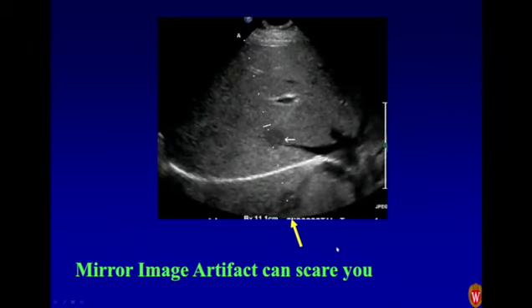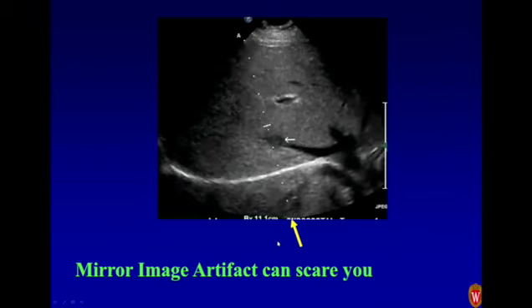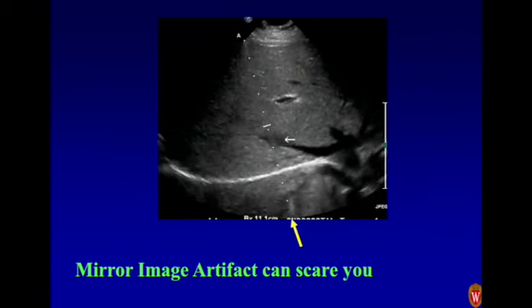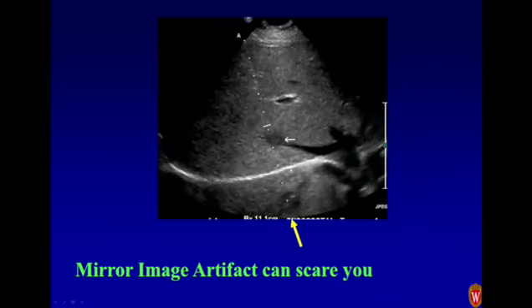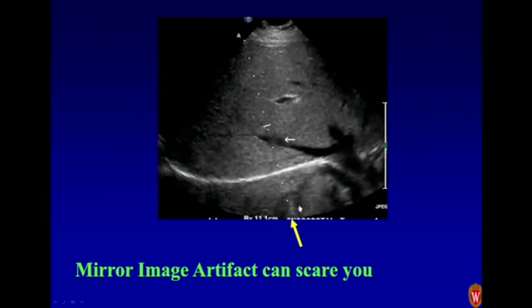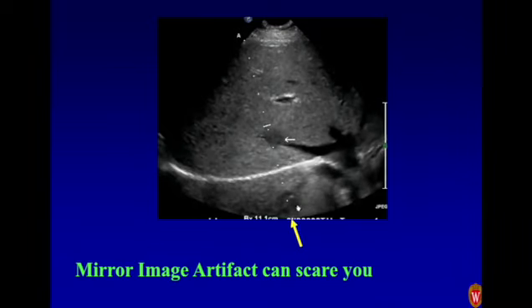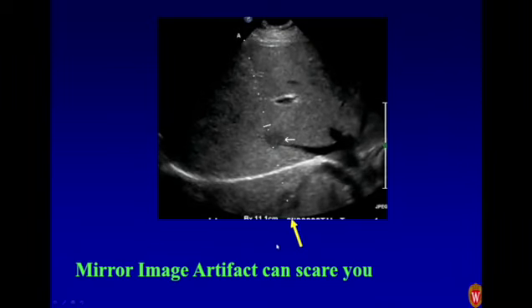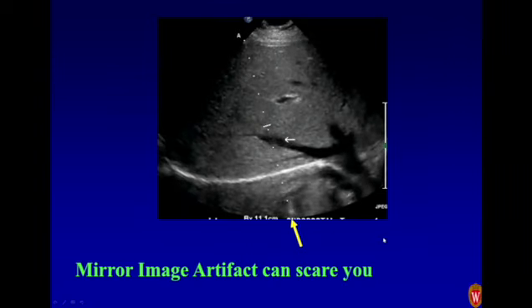Okay, here's an interesting mirror image artifact. We're going to biopsy. Snap and out. Did you see the artifact? Look down here. Okay, there's the diaphragm, and just pay attention over here. When I was watching the resident do this biopsy, I got scared for 1 second. That's not the biopsy needle tip. It was fortunately there in our lesion. This is all just mirror image artifact.